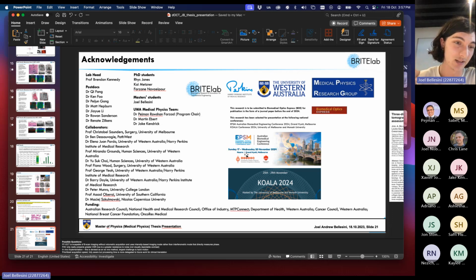In this project, we didn't really investigate the effect of changing field of view, which is a parameter which can be changed. It is a variable in our imaging. We didn't investigate how it influences dynamic contrast, which is something future work could look into, how varying fields of view influence the dynamic contrast that is obtained. But naturally, for our application on tumor margin assessment, we are looking at pretty superficial margins, for which we believe that the contrast derivable in OCT is sufficient.